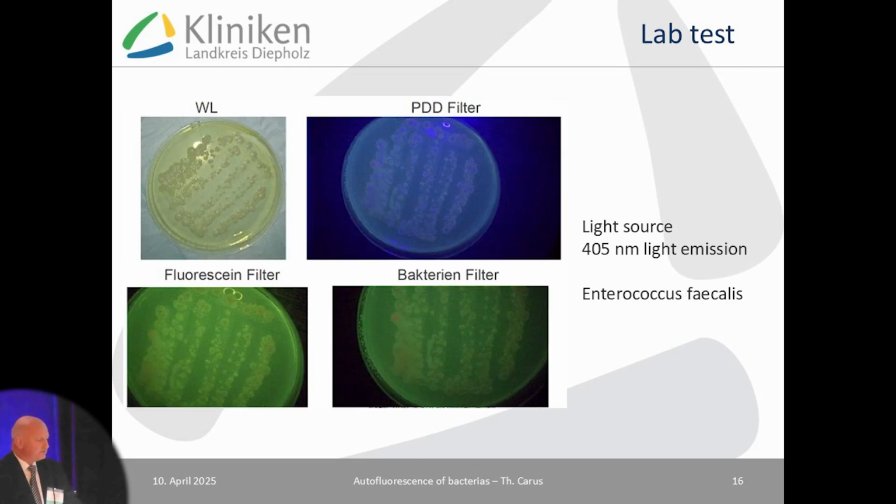But in this case, this was a perforated sigmoid diverticulitis. We could show Enterococcus faecalis, and you see a lot of red dots in these agar plates, and this is the red autofluorescence of Enterococcus faecalis.